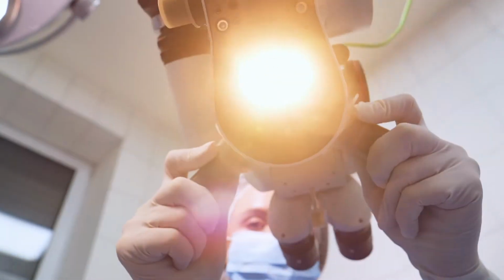So the time it takes to do one femtosecond laser LASIK, as opposed to the microkeratome, not only reduces time for the surgeon, but the microkeratome also leaves a better surface. So, in regards to handling that new volume that we're getting, it is much better to do it with a microkeratome.